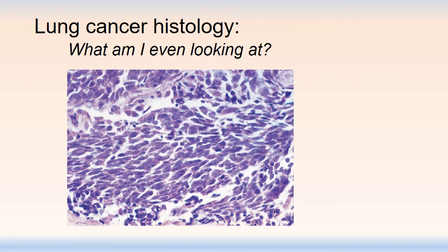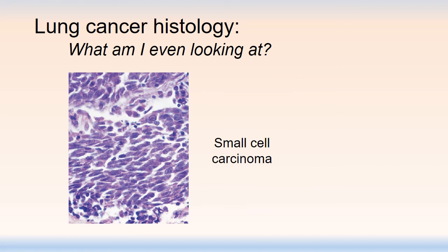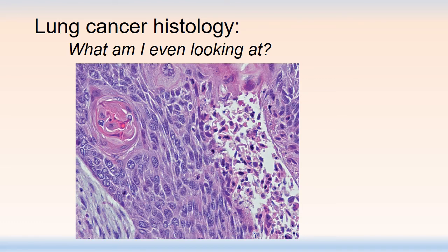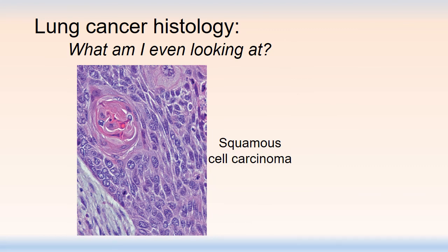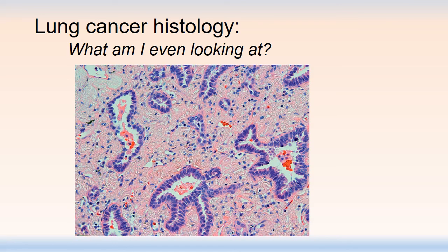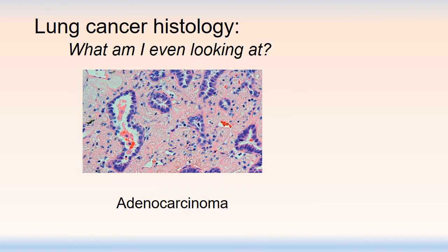Hopefully after going through this you can take something that looks like abstract art and instead say: I notice the nuclear molding and the small cells — that's probably small cell carcinoma. Or you might look at something and say, I see that keratin pearl, I think I even see some intercellular bridges — that's squamous cell carcinoma. And finally: this has glandular profiles in this neoplasm — this is an adenocarcinoma.